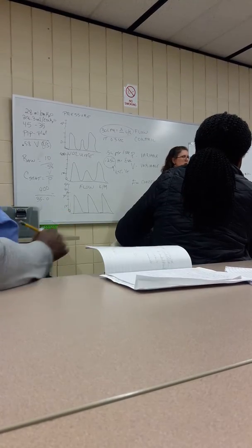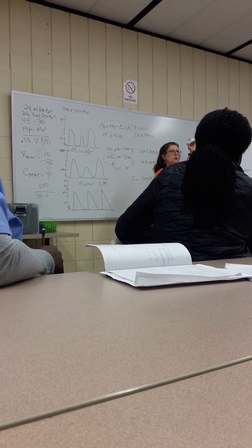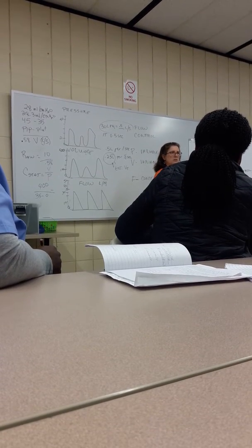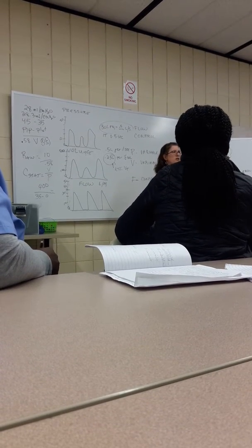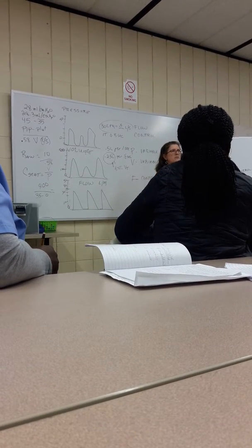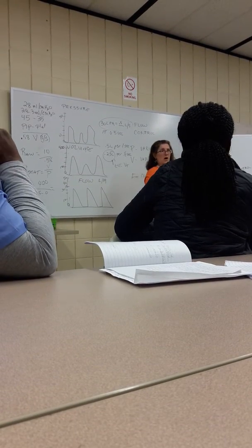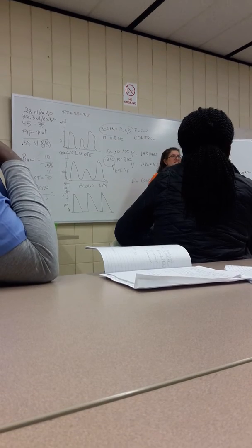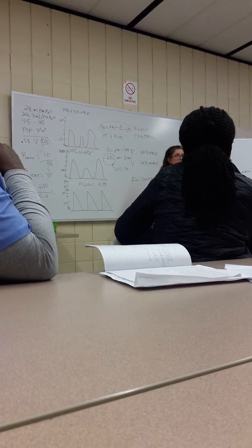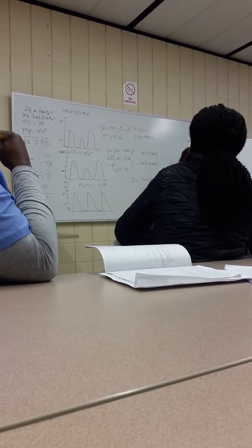For a machine trigger in pressure controlled ventilation, what is gonna be the trigger for the ventilator to give the breath? Time. Okay, that was for pressure control.